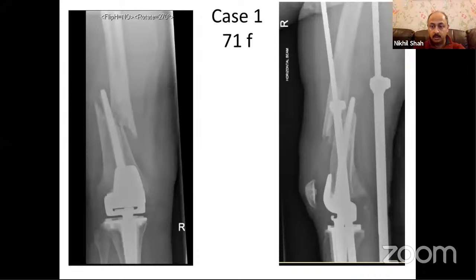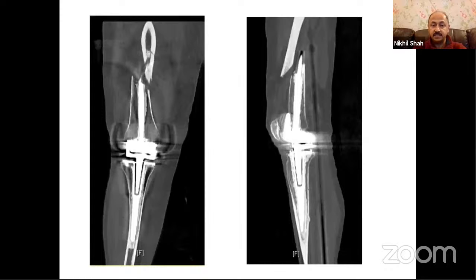The question to ask in these fractures is very similar to what we ask in the hip. Was the knee a happy knee? Was she happy with that knee, or was she not happy with that knee? In other words, was the prosthesis stable or not stable? Because that will decide whether you want to revise it or you want to try and fix it. So we find a CT scan quite helpful in these cases, because they show you quite nicely that the prosthesis is still well fixed. It also shows you that the long spiral fracture extends much beyond what you think you can see on the X-ray. So based on this, a decision was taken that I could probably fix it.